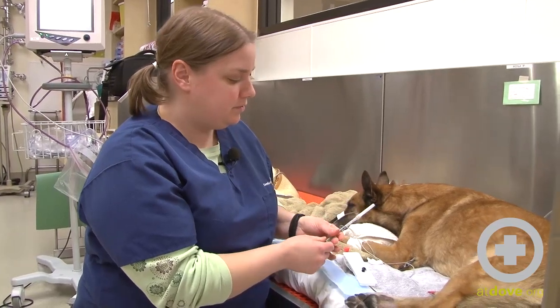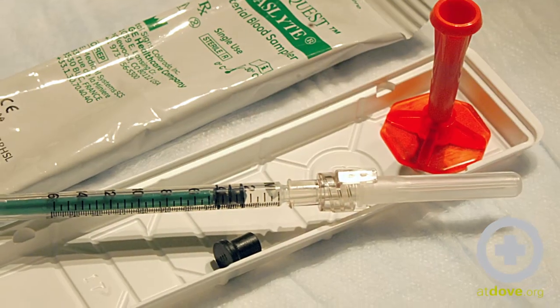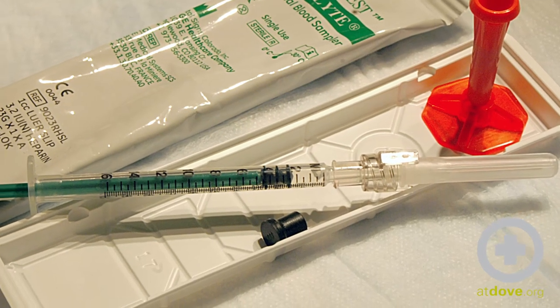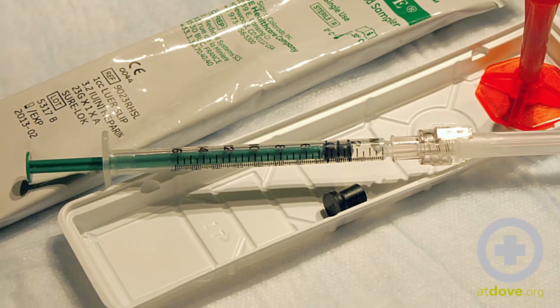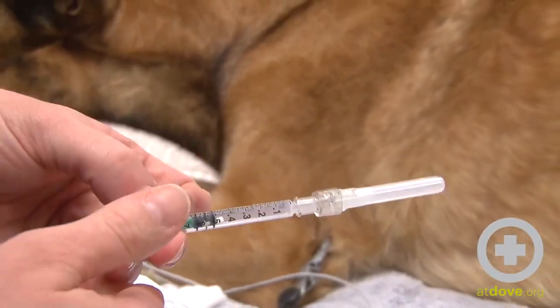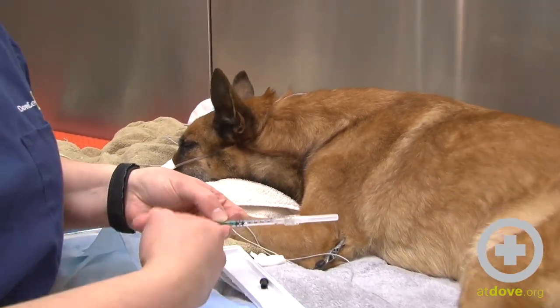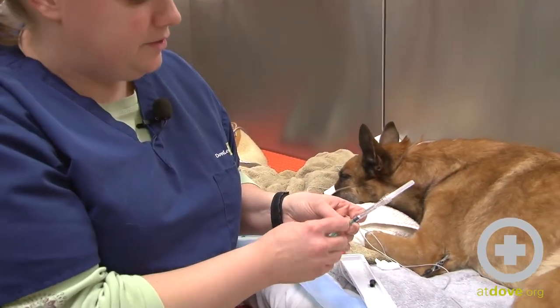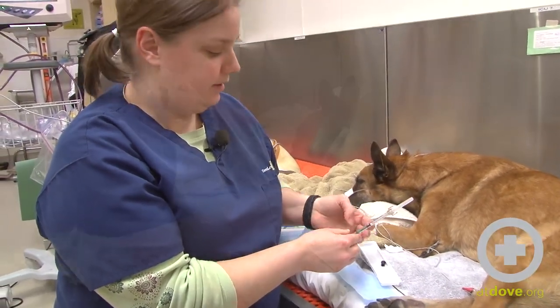I'm going to use a special arterial blood gas syringe. This syringe has tiny micro holes in the plunger so that it will self-fill. I'll need about a half a mil of blood. I just pull the plunger back, and when I poke this into his artery it will fill on its own, and the air in the syringe will come out of these little holes. This little white ball here is lithium heparin, which is the anticoagulant.